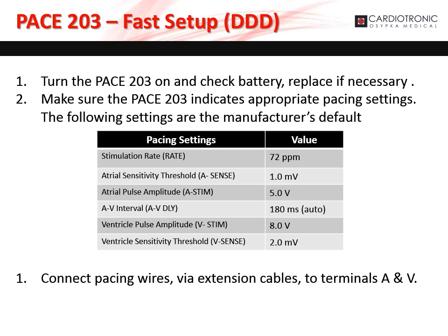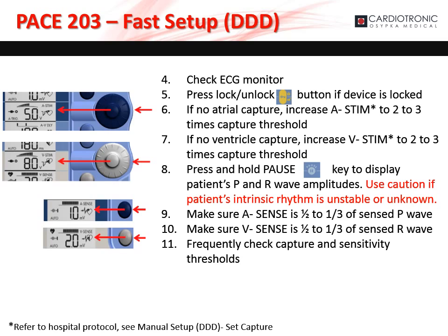Turn the PACE 203 on and check the battery; replace if necessary. Make sure the PACE 203 indicates appropriate pacing settings — the below table indicates the manufacturer's default settings. If you have the appropriate settings, connect the pacing wires via extension cables to terminals A and V. With the PACE 203 hooked up to the patient, check the ECG monitor to ensure proper capture. Press the lock and unlock button if the device is locked. If there is no atrial capture, increase A-STIM to two to three times the capture threshold. If no ventricle capture, increase V-STIM to two to three times the capture threshold. Press and hold the pause key to display the patient's P and R wave amplitudes. Please use caution if the patient's intrinsic rhythm is unstable or unknown. Make sure that A sense is one-half to one-third of the sensed P wave, and V sense is one-half to one-third of the sensed R wave. Frequently check the capture and sensitivity thresholds.